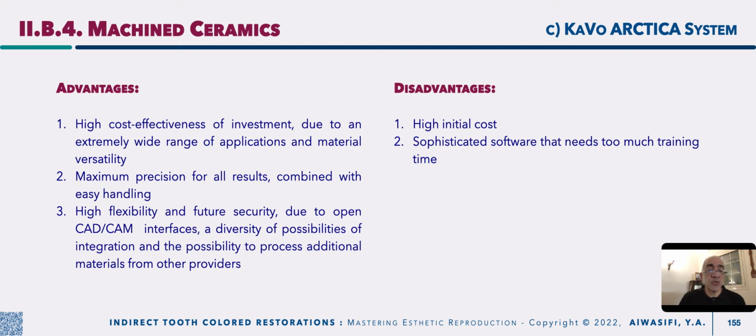It allows you to do this, and each block could be used for construction of multiple restorations according to its surface area, because the system allows you to calculate the needed material for your workpiece, and if there is a remnant of the block, it could be used for another piece. If you use a large block, you could save the wasted material by designing 2 workpieces from the same block, if the thickness allows this.